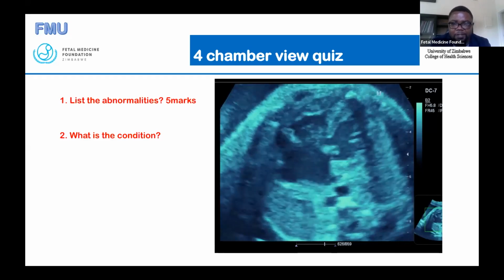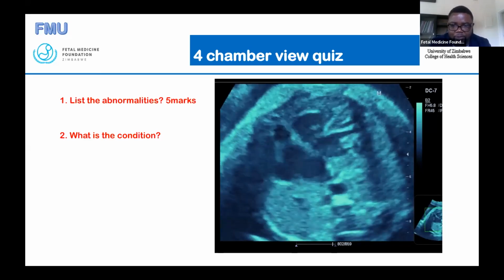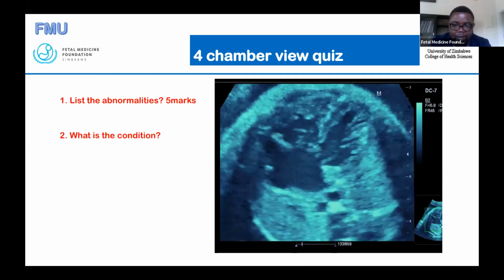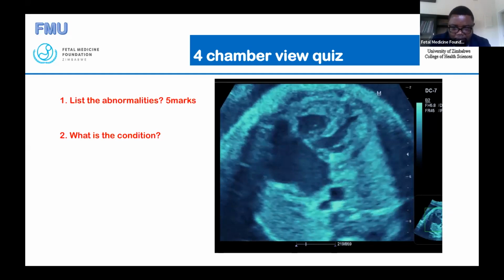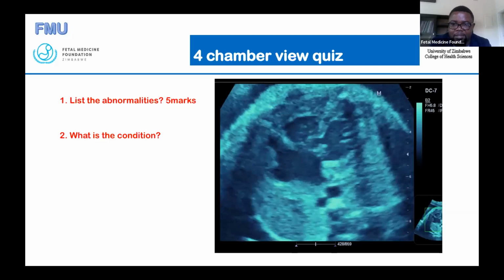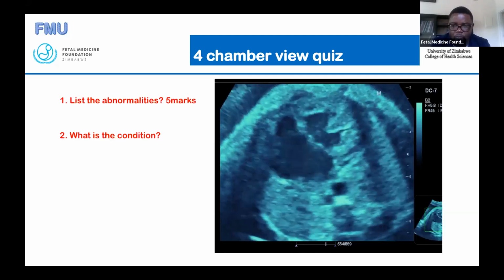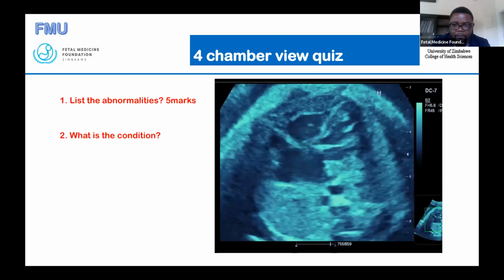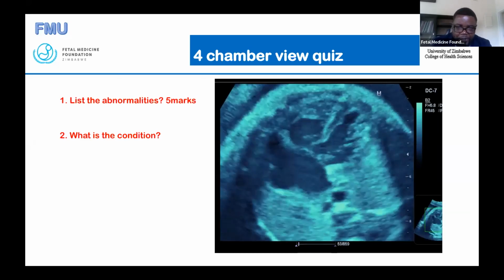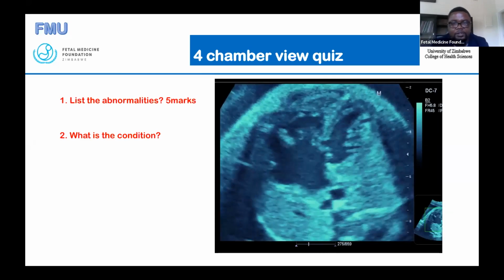So list 5 defects that you can identify. Don't say, why is it moving? Fetal echocardiography is better to interpret a moving heart than a still heart. Because if I made this video to stop, it will look totally different. You may miss some of the things that we are seeing as the heart is moving. And finally, what do you think is the pathological condition here? What is the underlying heart defect we are dealing with in this case?